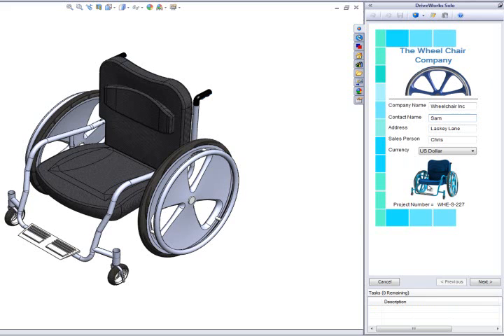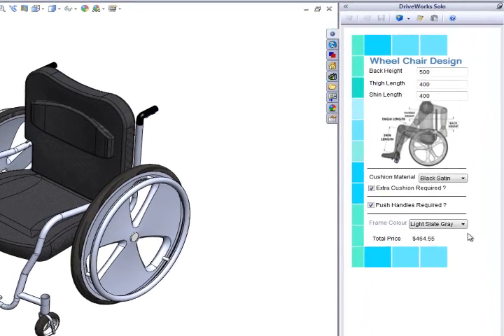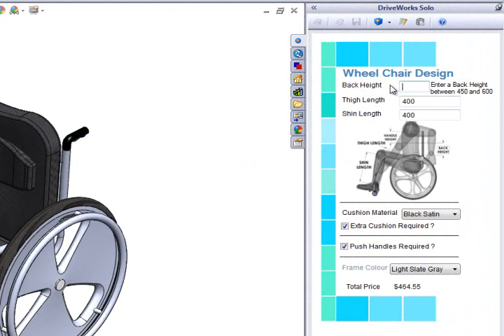Moving on to the next form, we can now start to create our wheelchair. We will start by selecting some dimensions. We can choose our back height, and again these text boxes have alerts and guidance linked to them to ensure that the number entered here is a valid value.